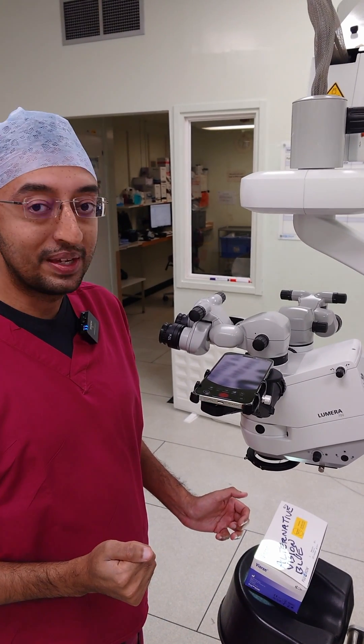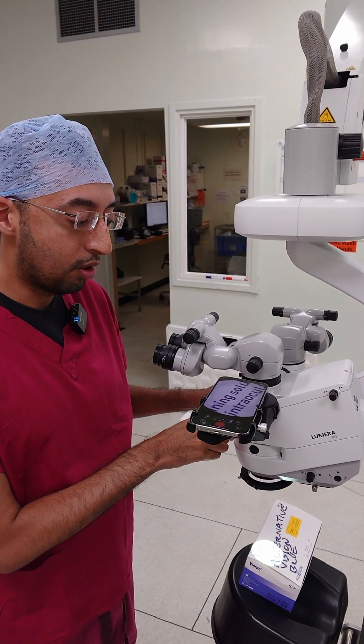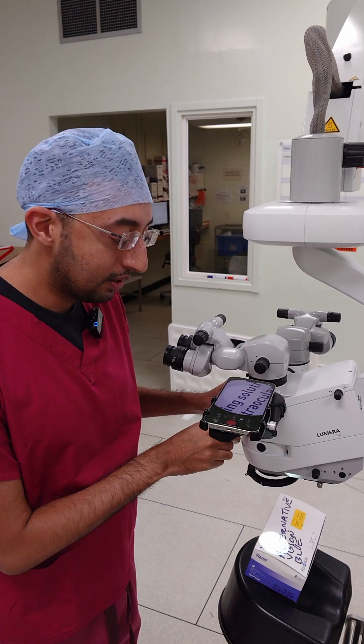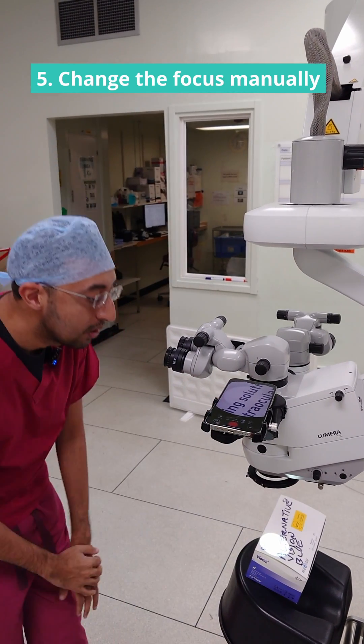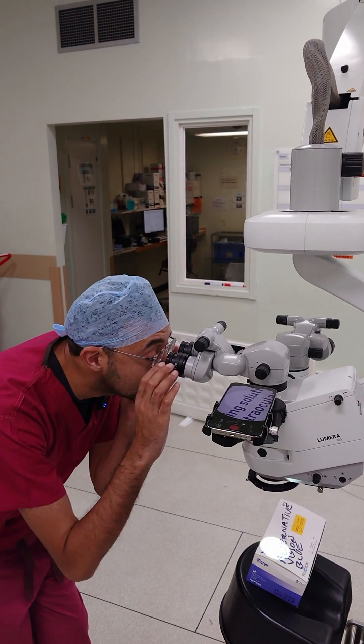The next thing to do is the focus. What I like to do is get the focus perfect on the screen like it is there — that's actually perfect. Then once I've done that, this view is slightly out of focus, so what I'll do is I'll cover each eye.